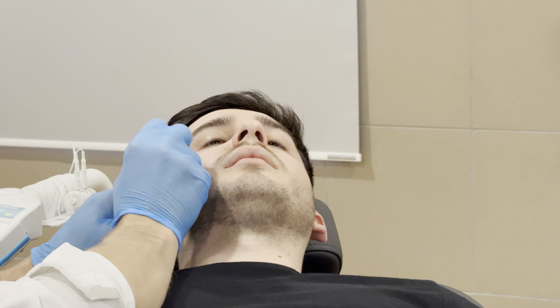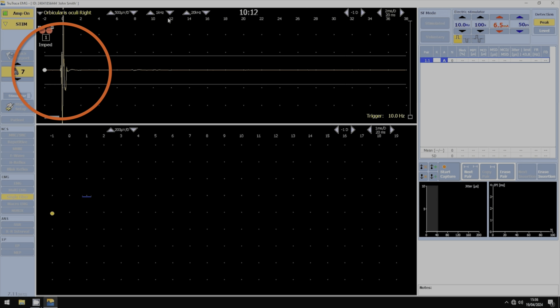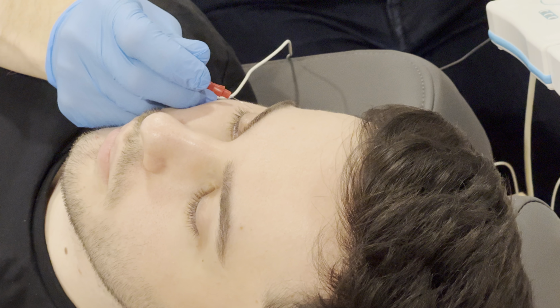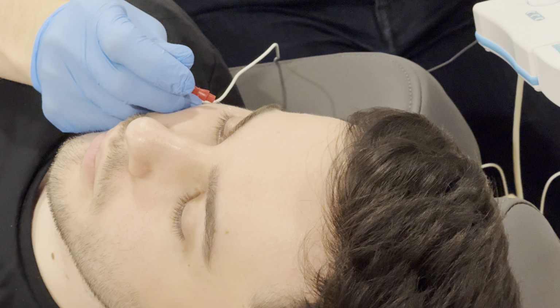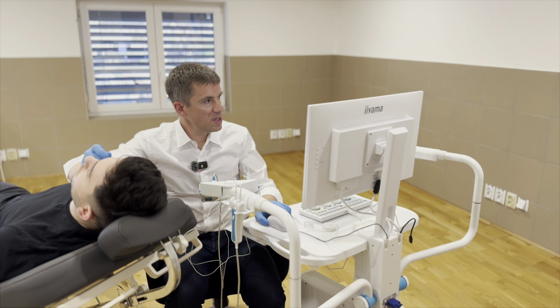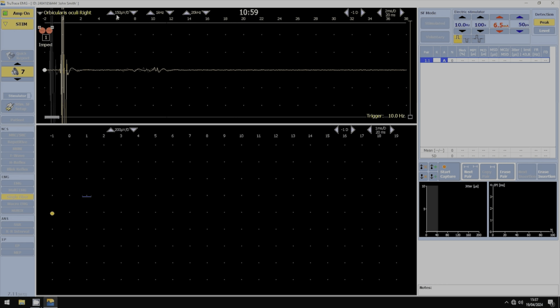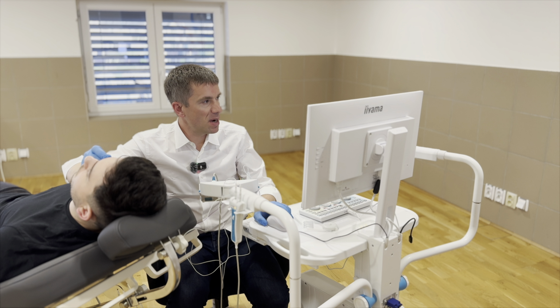I'll put the needle in the orbicularis oculi, and we see at the beginning of the screen our stimulation artifact. After the stimulation artifact, I'm looking for individual muscle fibers. We need muscle fiber activity of 300 microvolts, which means with a gain of 150 microvolts per division, I need to find muscle fibers of 2 divisions. So let us try to get stable activity of muscle fibers of at least 200 to 300 microvolts. This is done by turning the needle and by adjusting the position of the concentric needle in the muscle.